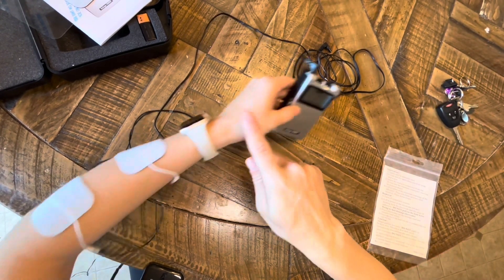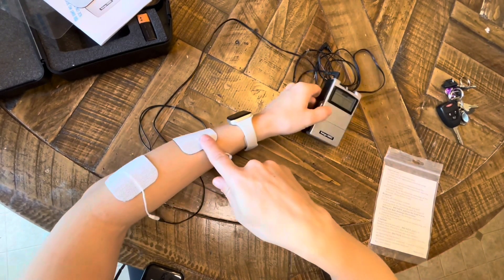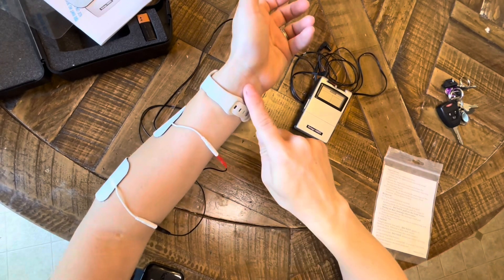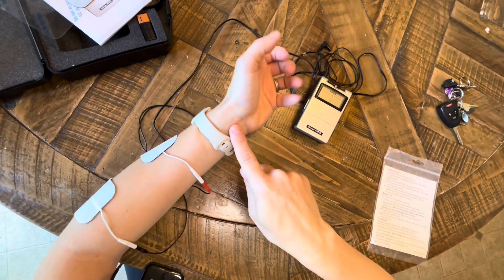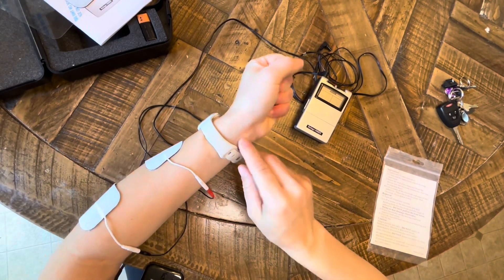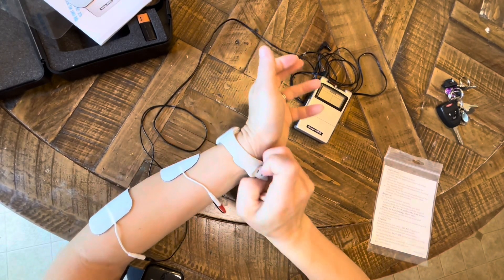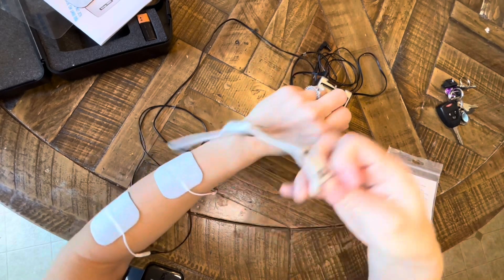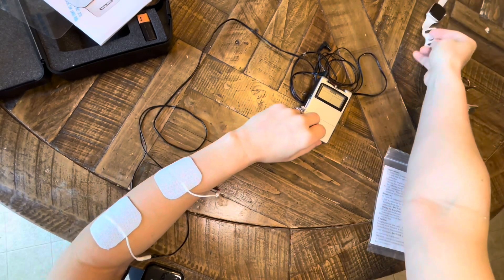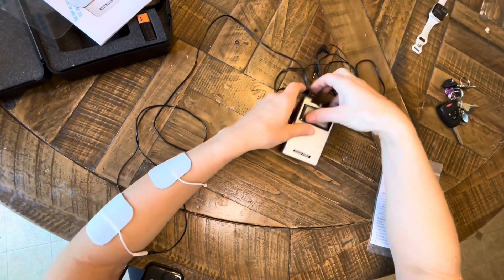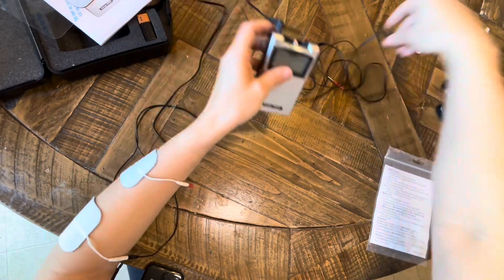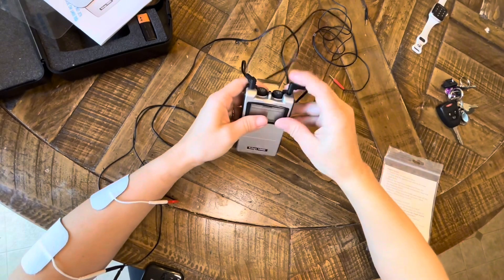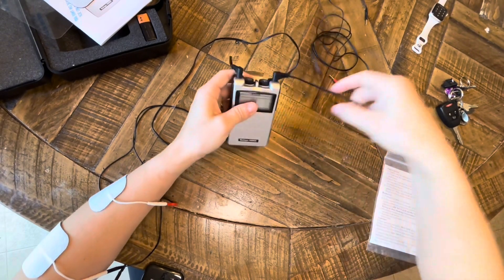So I just showed you there that you can work on grabbing keys or whatever item that you want, either in preparation to grasp them or to have the hand open up to release them.